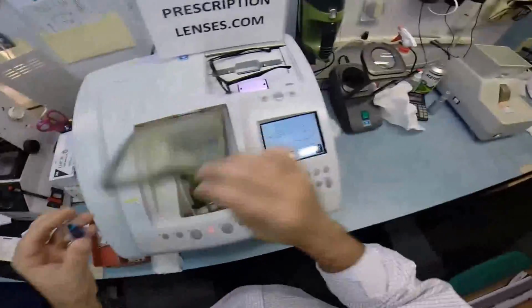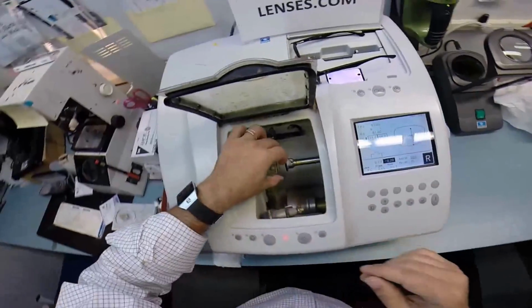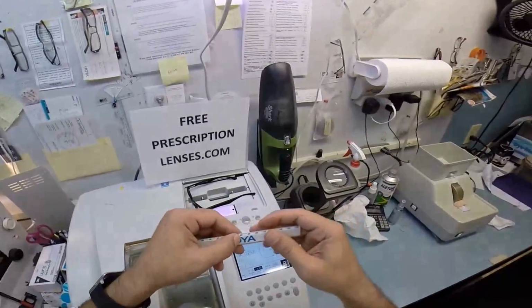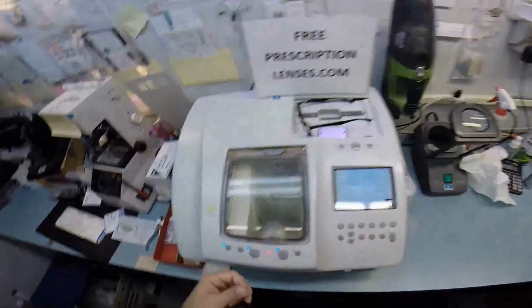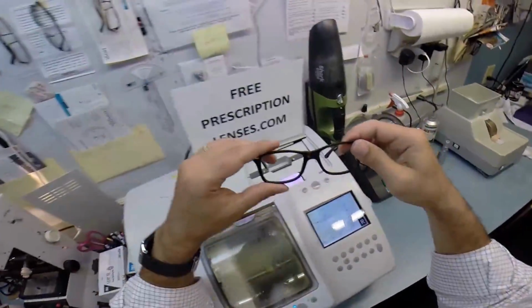With my thumbs, I'm going to use a hammer. Where's the tool? I'm going to beat this in there. No, I'm just kidding. I'm going to take this down about 0.2 of a millimeter until it snaps in very easily. Now, a millimeter to all my American friends is the distance between my thumbnails. I'm going to take 0.2 of that, which is 1/5, according to my new math, all the way around the circumference of your lens until it snaps in your frame easily.